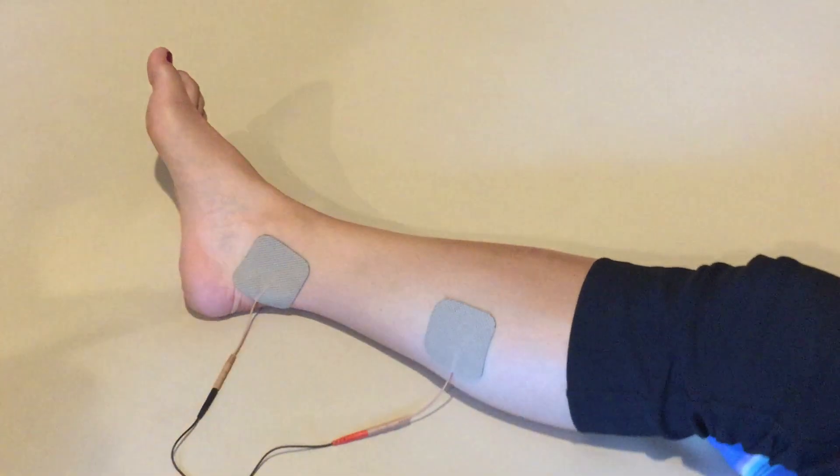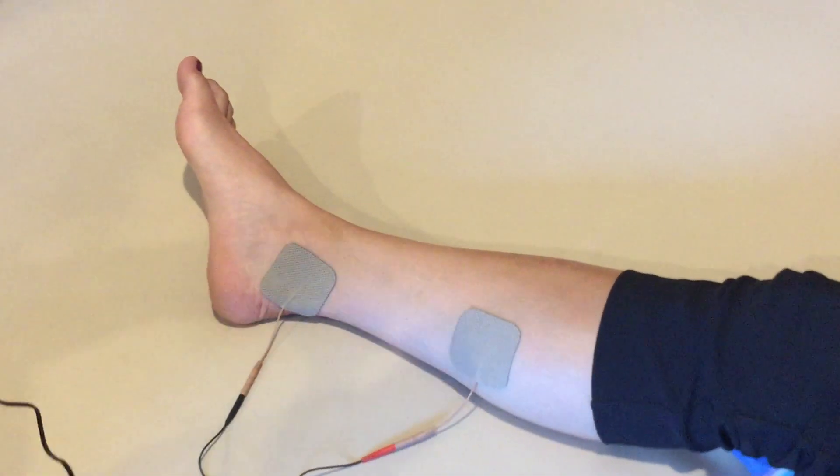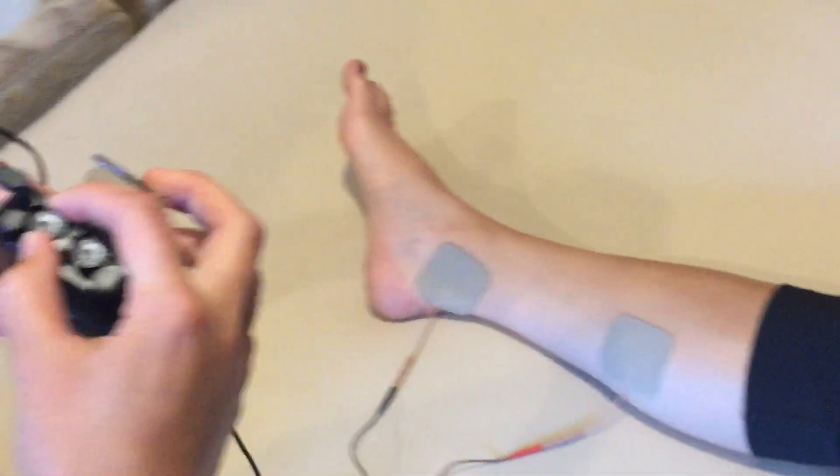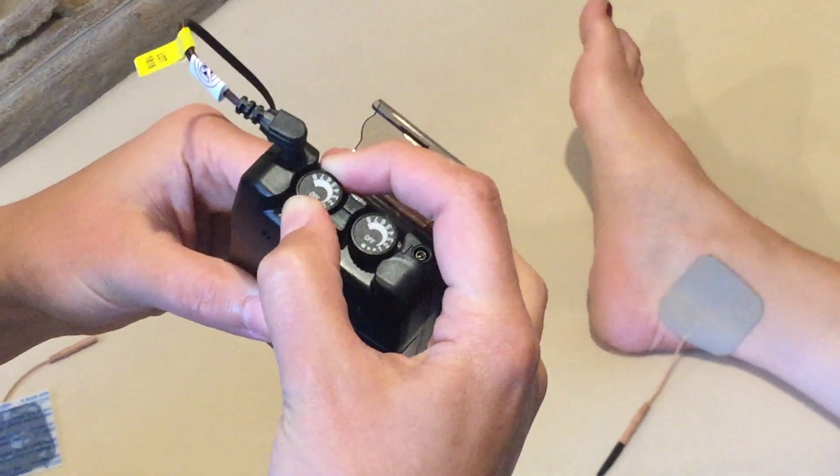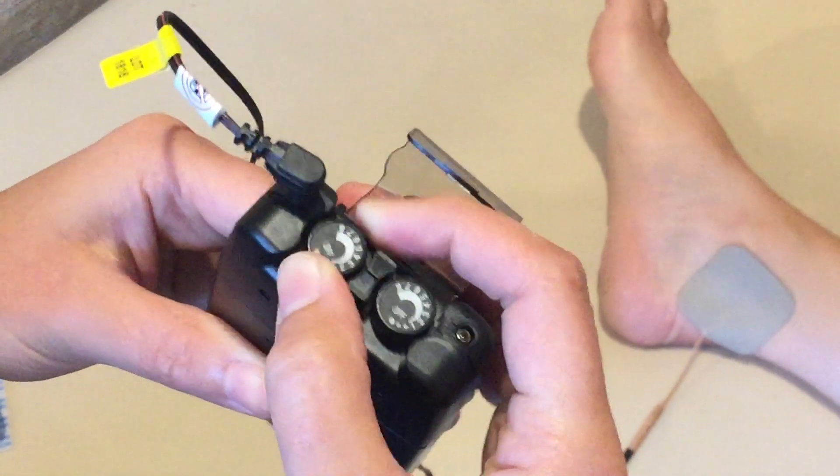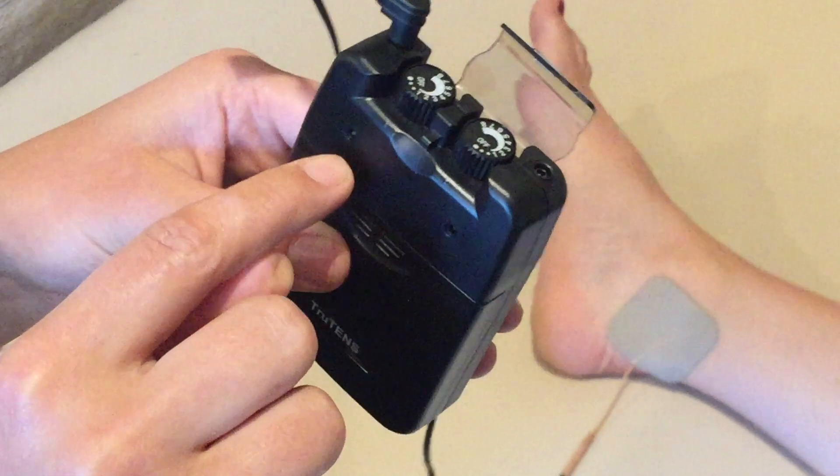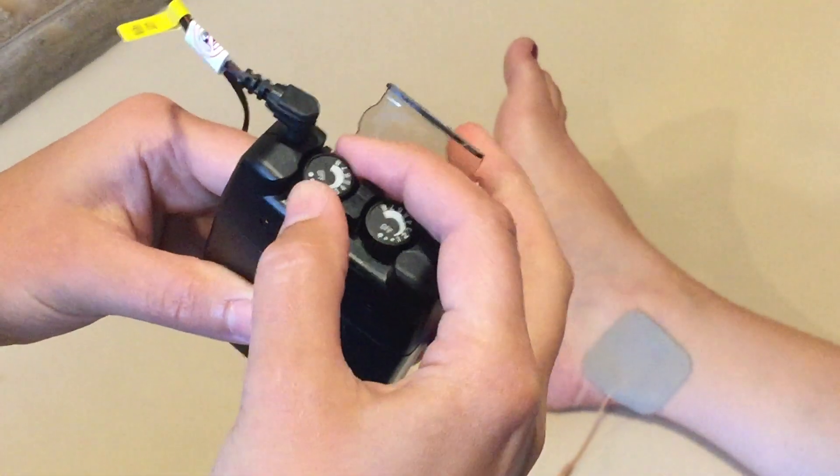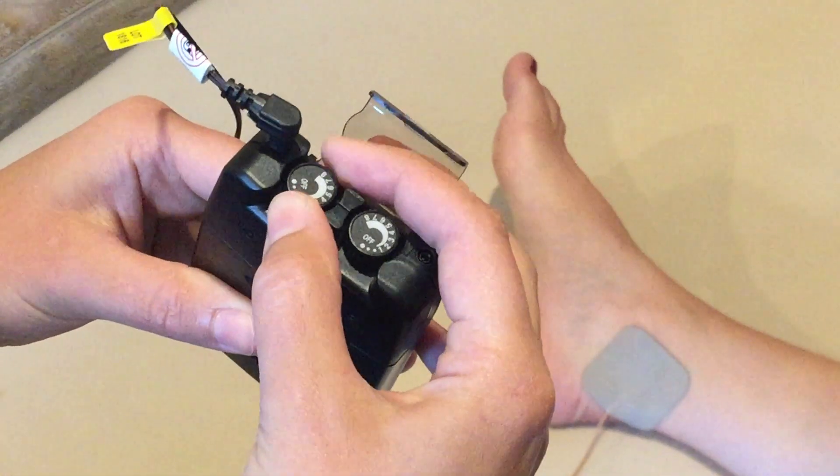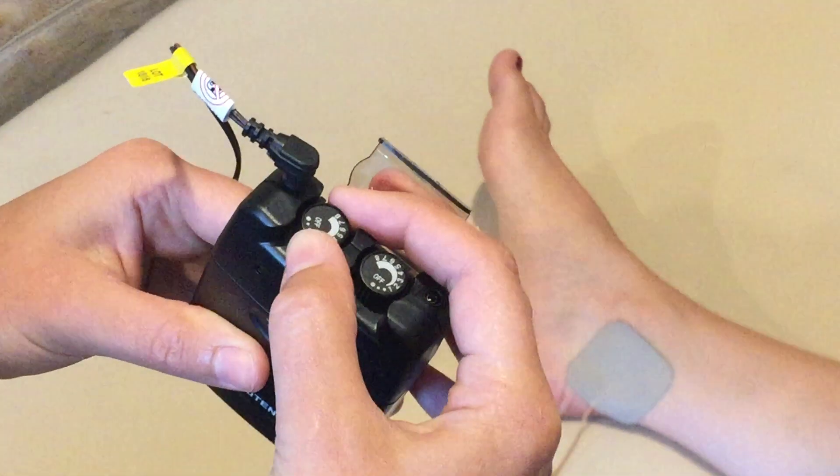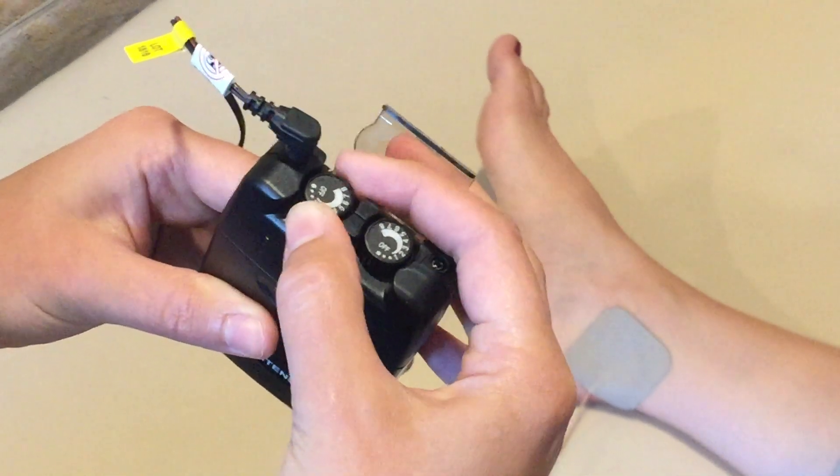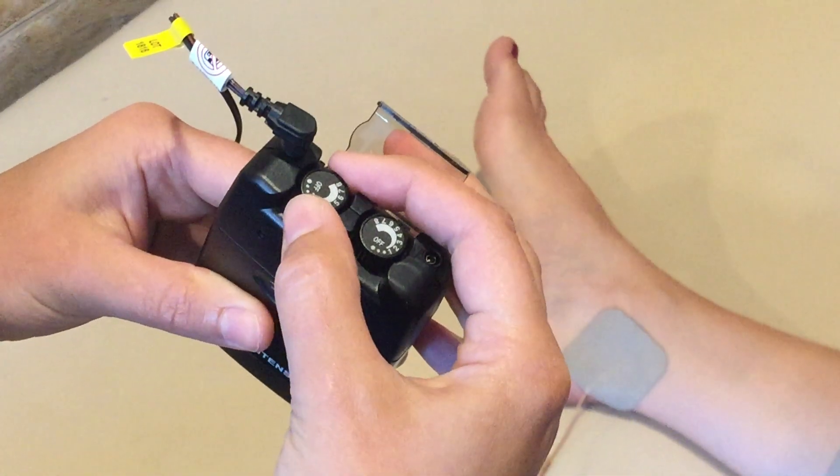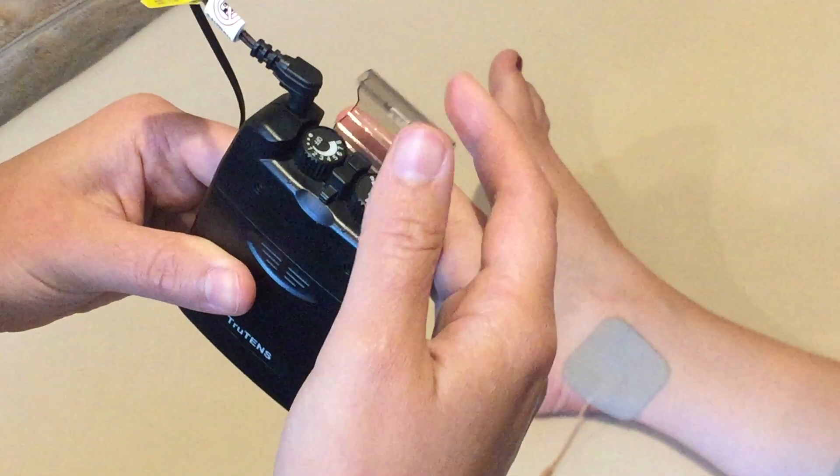Once your electrodes are firmly in place then you can start slowly turning up the dial. You should hear it click to turn on and your light should turn yellow. We want to turn it up until it's strong but comfortable. Yeah, that's a good level.